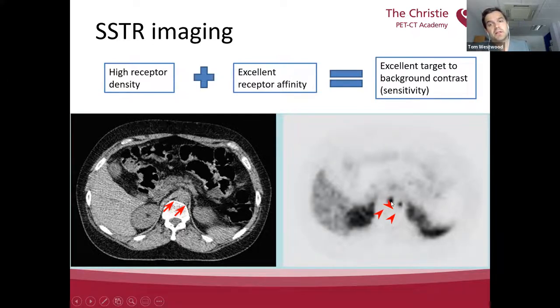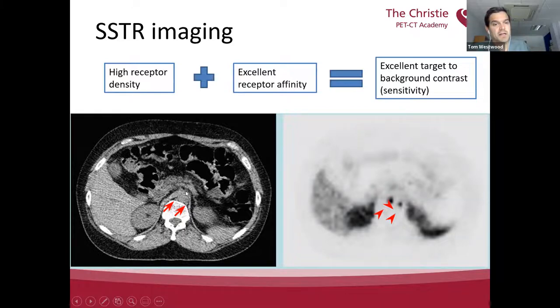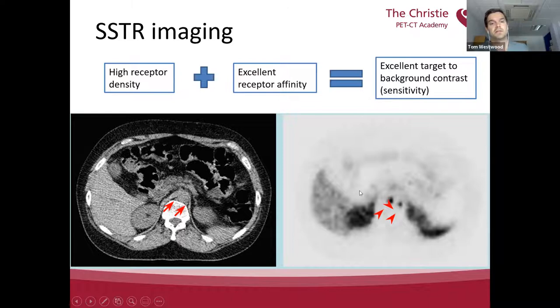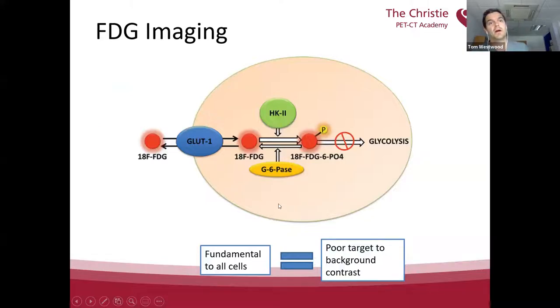Here is an example on CT scan: two tiny nodules either side of the aorta, only a couple of millimetres across, but showing really high uptake on the DOTA-peptide PET. You get very good sensitivity for small lesions when you have the right tumour biochemistry. Contrasting that with FDG — with FDG you're imaging glucose metabolism, and to my knowledge all cells in the body must metabolise glucose to survive.